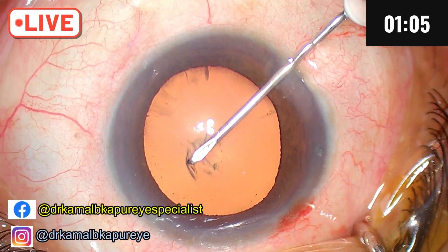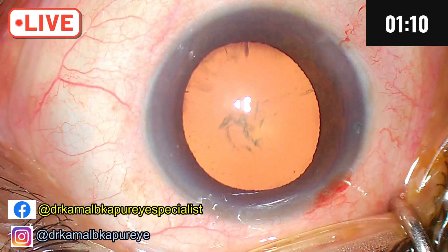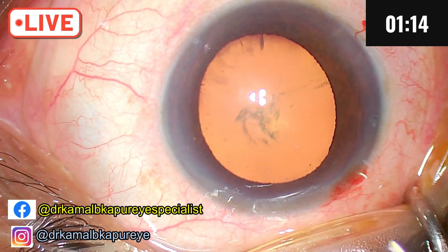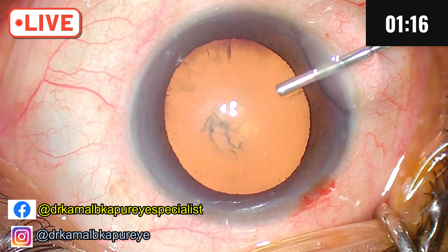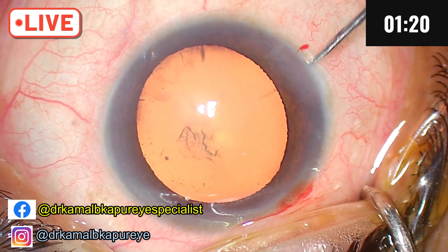We notice that the chamber is totally shallow — it keeps collapsing. Since this is a shallow chamber, I will change the strategy and use a cystitome. We can use sodium hyaluronate in such cases.